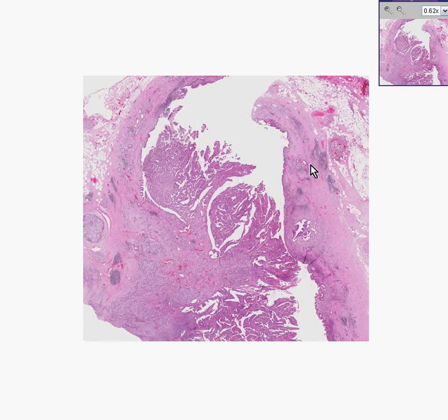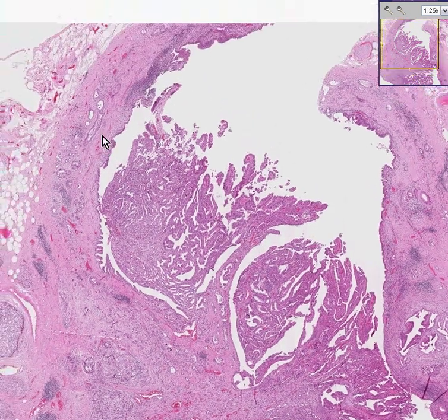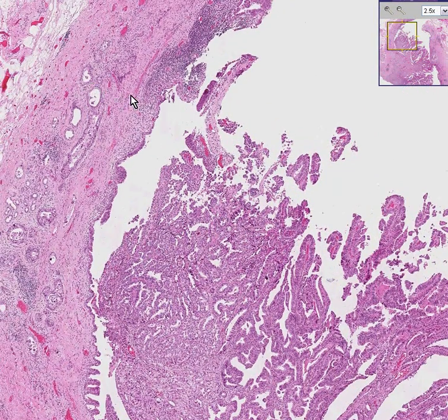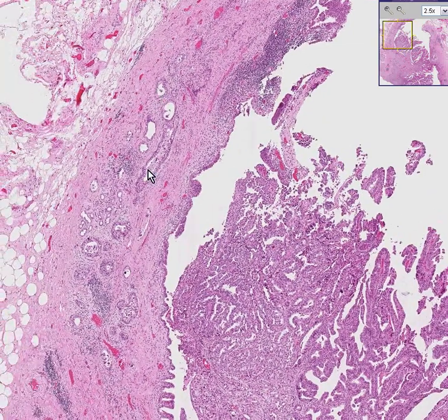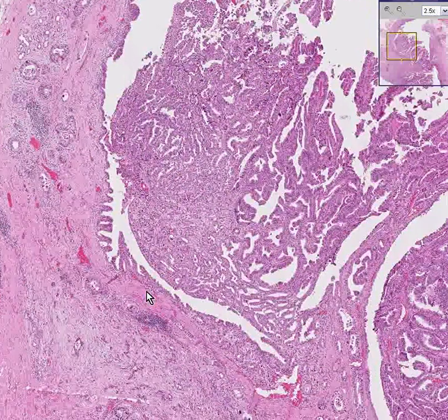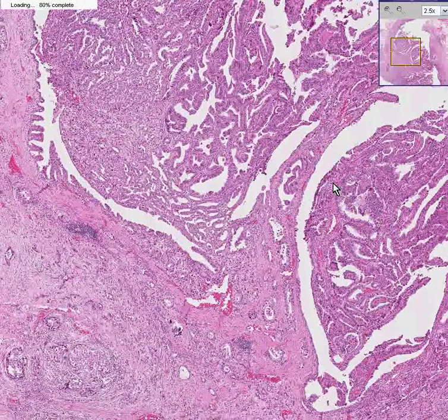Could it be a common hepatic duct, or perhaps the common bile duct, which is the convergence of all of the ducts? And it looks like it could be a common bile duct, and maybe that's why they named it common bile duct. The reason why this is a rare thing is because we are privileged to see that on the inside of this duct, and apparently originating from the mucosa of this duct, is a large tumor.